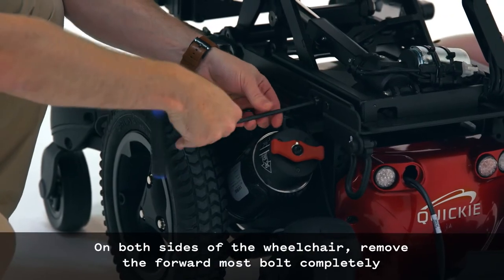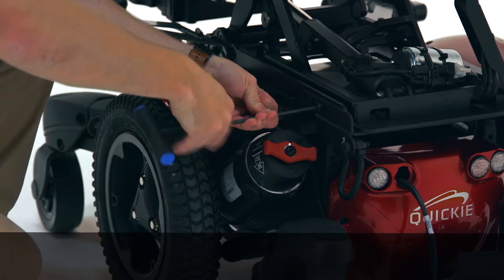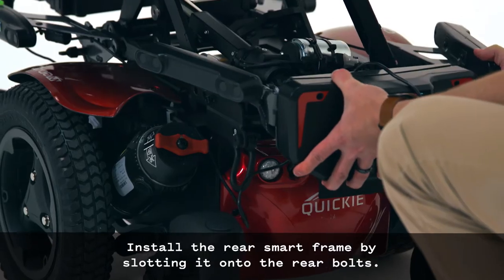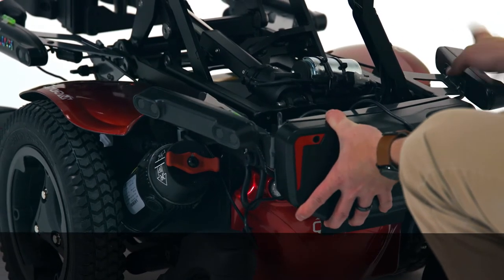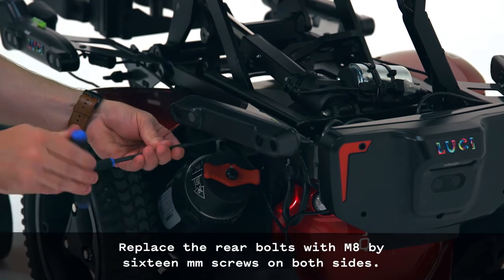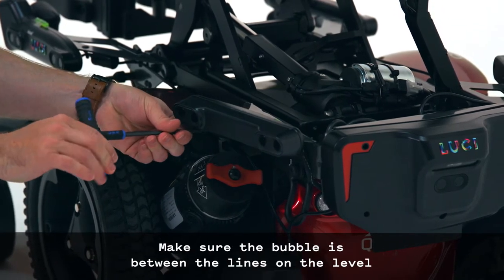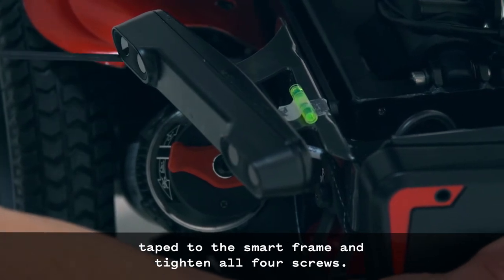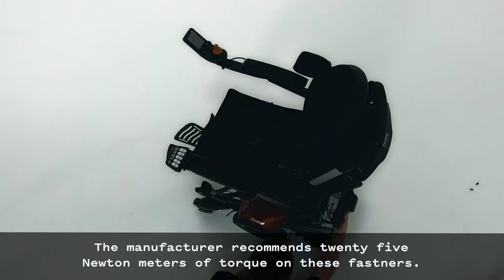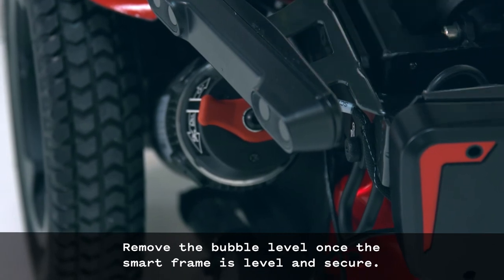Use a 5mm Allen wrench to reattach the rear cover on the wheelchair using the original bolts. On both sides of the wheelchair, remove the forward-most bolt completely and then loosen the rear bolt. Install the rear smart frame by slotting it onto the rear bolts. Replace the rear bolts with M8 x 16mm screws on both sides. Make sure the bubble is between the lines on the level and tighten all four screws to 25 Nm. Remove the bubble level once the smart frame is level and secure.